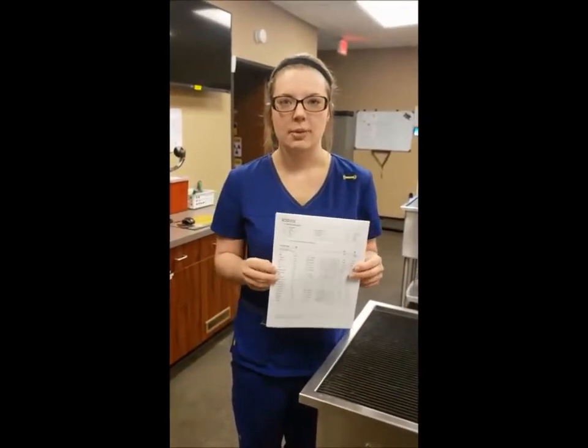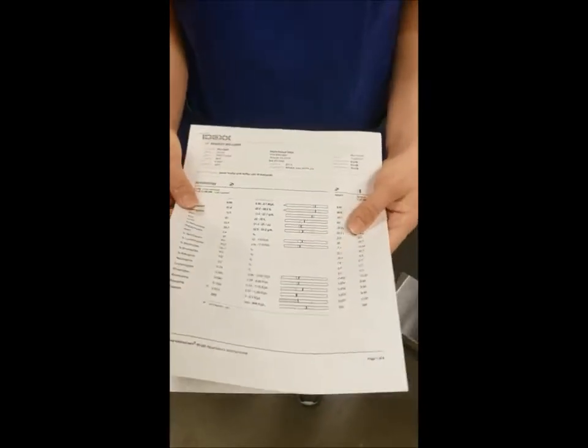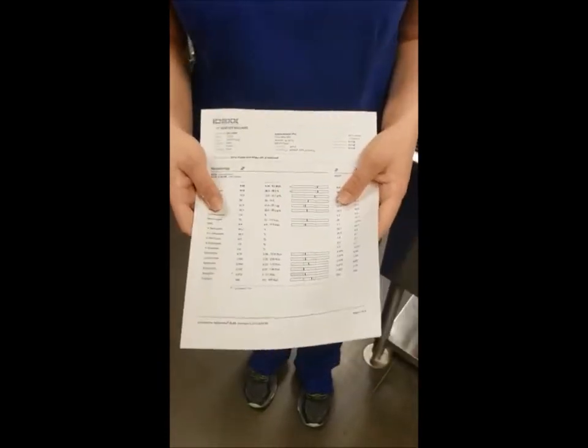Okay, this is our patient's lab work that we just performed. This form shows all of our values. We have a complete CBC, chemistry, and electrolyte panel. This will tell if our patient has any abnormalities such as elevated liver or kidney values. We've also got a urinalysis here, and a thyroid test. If there were any indications that this patient is not a good candidate for anesthesia, we would be able to tell, and then we would forego the operation.